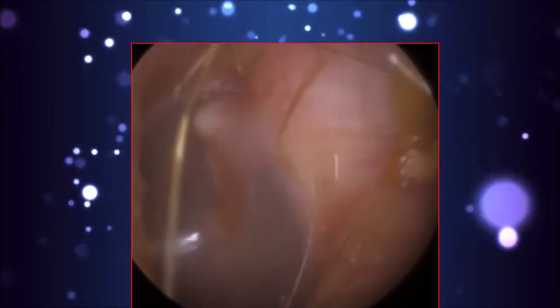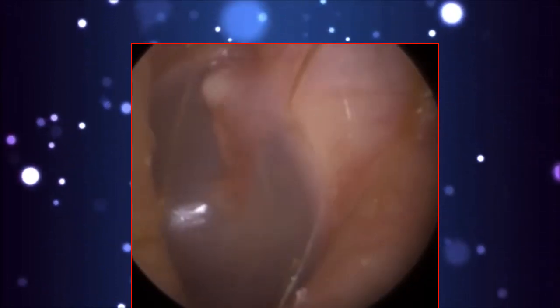And I'm just thinking, can I get in? And I've just grazed it there. Can you see it? You can see the skin that's just grazed. And the patient flinched, and obviously I moved out. So decided just to leave the rest. Again, slight attic retraction at the top.